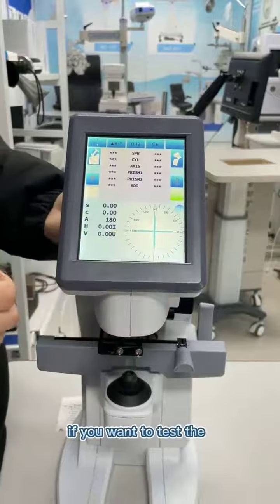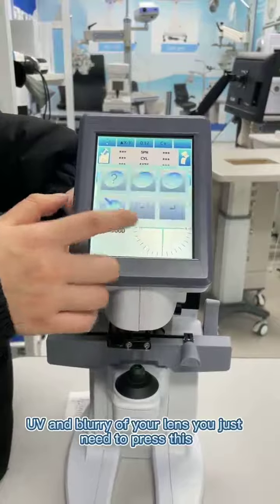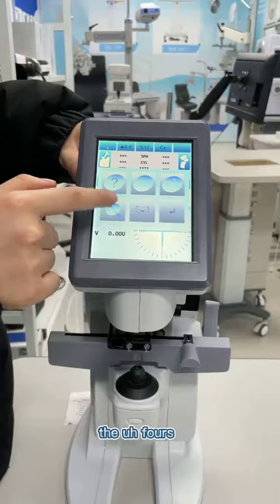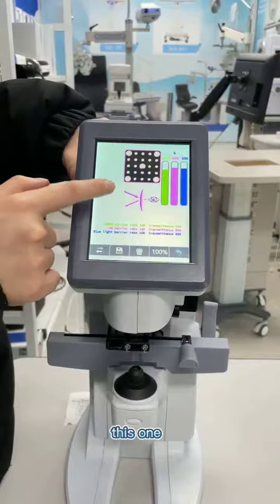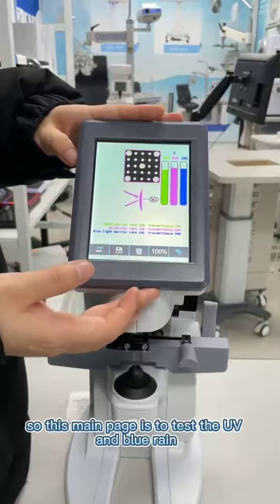If you want to test UV and blue-ray of your lens, you just need to press this and here — 1, 2, 3, 4 — and then this one. So this main page is to test UV and blue-ray.